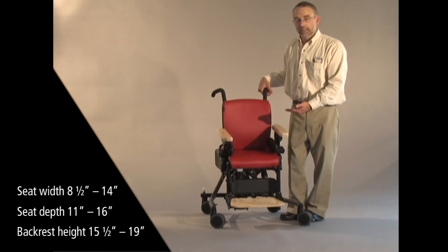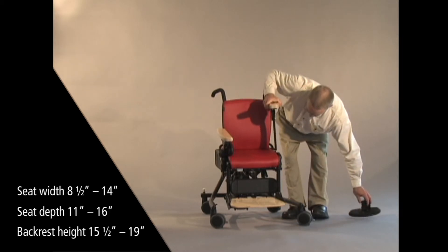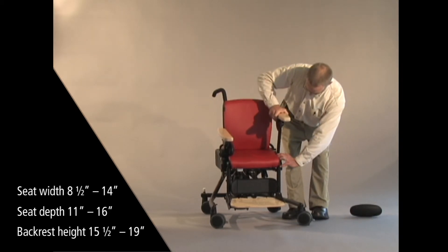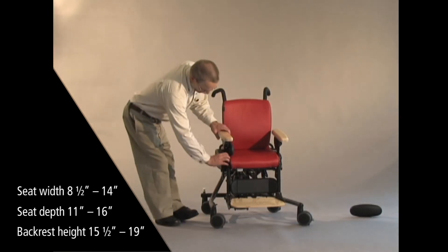To get wider than that, remove the hip guides — pull the armrest out, pull the hip guide off — and then you will get to a full 14 inches of width.